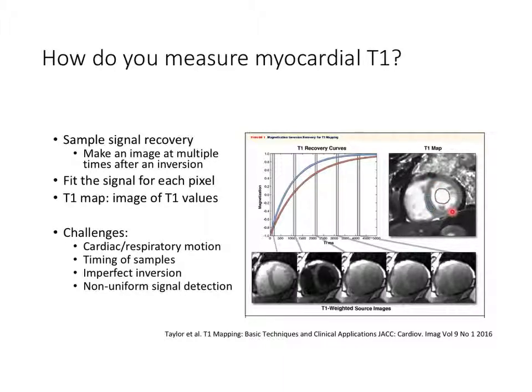So how do we make that measurement? Well, we know that the signal will recover with this curve, and if we can get data points along this curve, we can just fit that exponential, right? Just fit the optimal T1 value to put those points on a curve using a least squares fit.